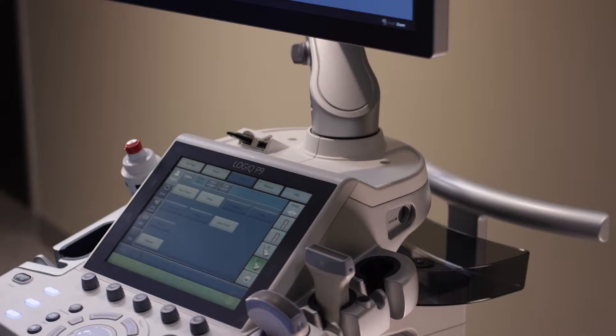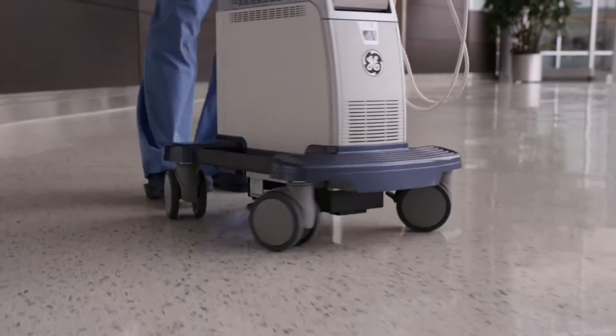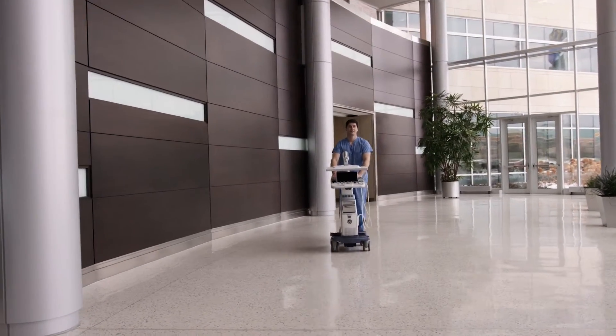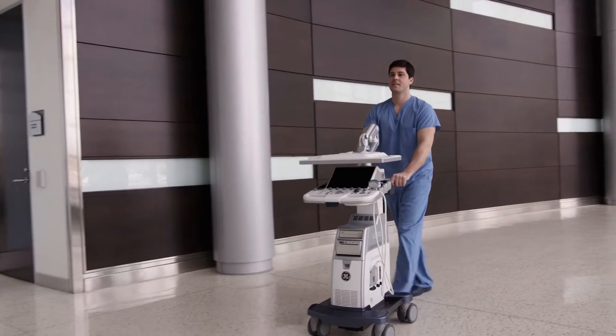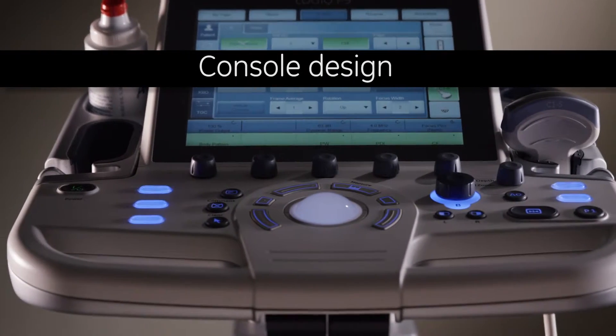Other system features include an optional rear handle, gel warmer, and wheels that glide and lock. The power assistant feature helps make transport easier. Unplug, transport, then plug back in and be ready to scan in seconds.